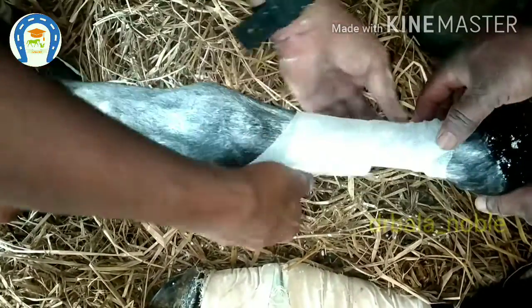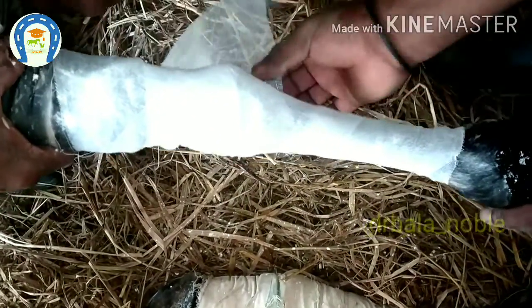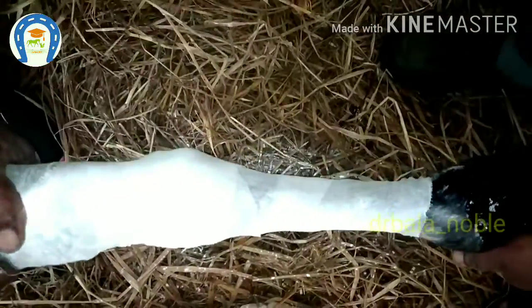Padding is very very important for splint application, so we have to apply good cotton. I am applying a bandage roll first because the cotton will slip away, so to secure the edges I applied the bandage roll.